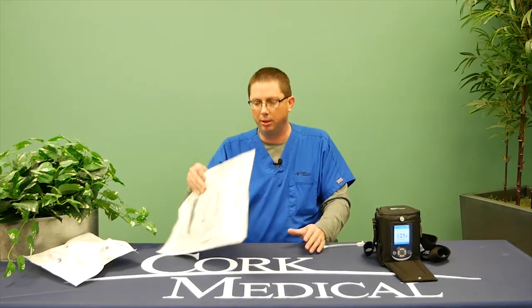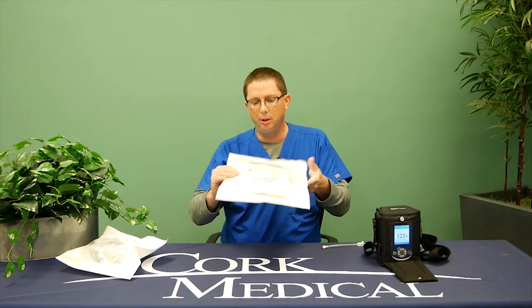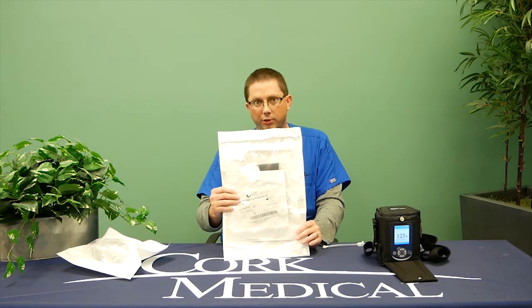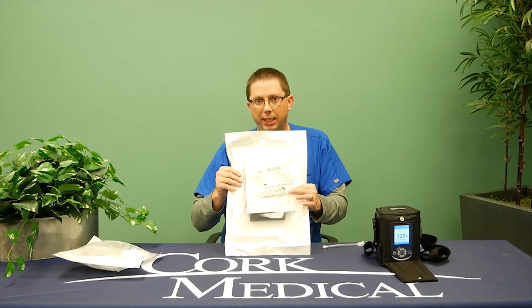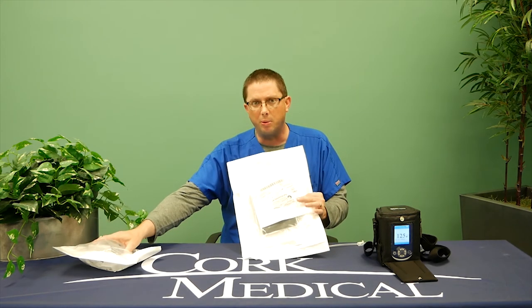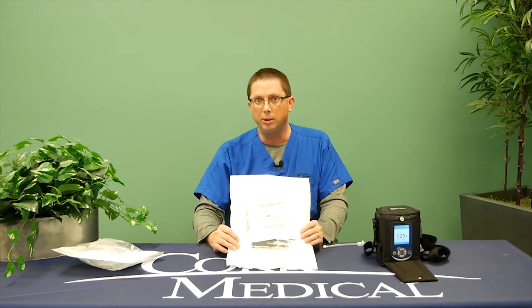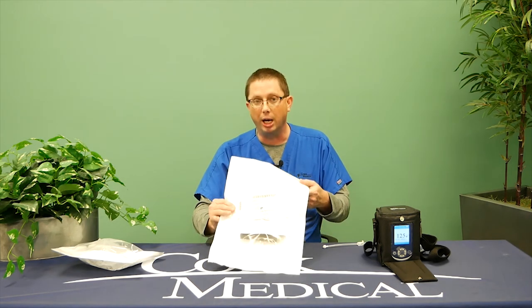You will be sent the dressing kits and canisters in the same box. Dressing kits are changed two to three times a week based on your physician's preference and order — your home health care provider will change those. Canisters are changed once a week or when full. We send you enough kits to last the entire month: 15 dressing kits and 10 canisters. If you start running low before the end of the month, please call Cork Medical to request more items before you run out and we will ship you more.